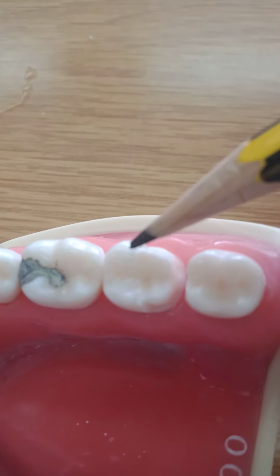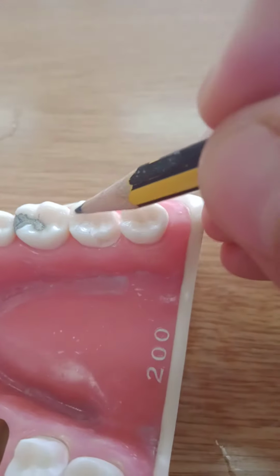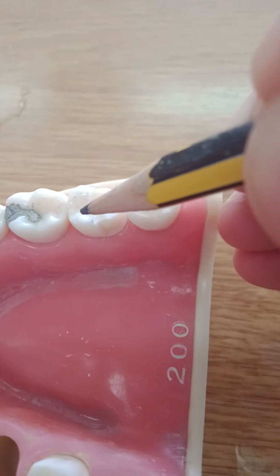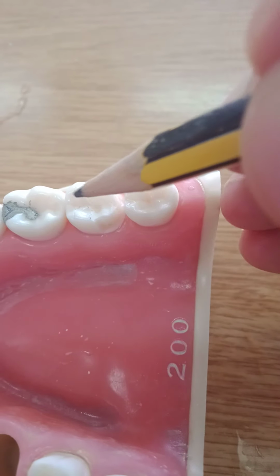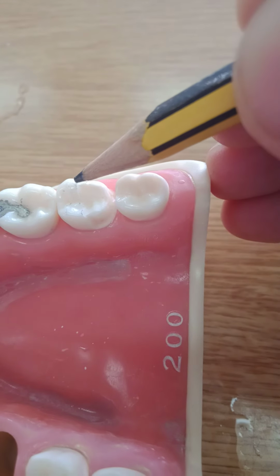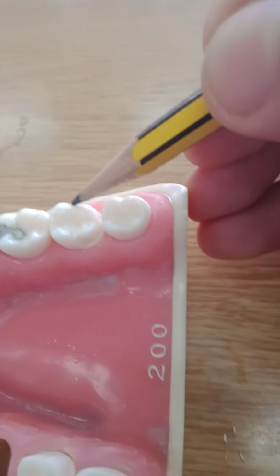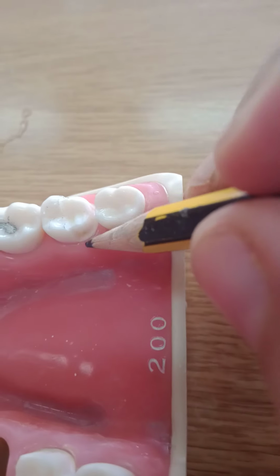You might even reach up to here, and you leave only this part. You're okay wherever you stop, going closer to the contact area. But the idea is, if you're doing a half crown, at least bypass the half of the crown buccally and lingually. So you have some place to place a groove here, but you don't have it here.